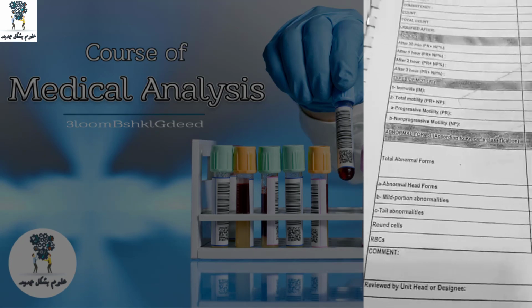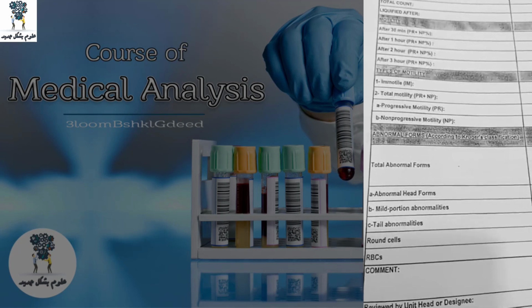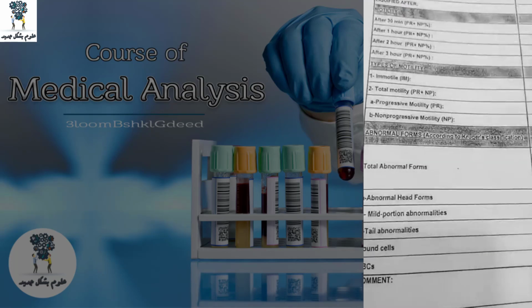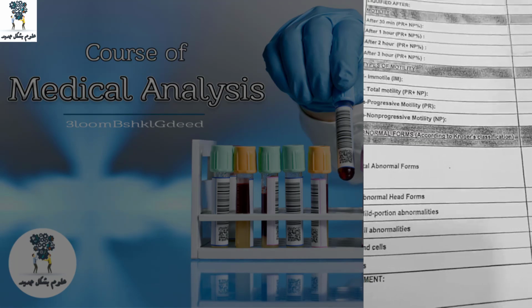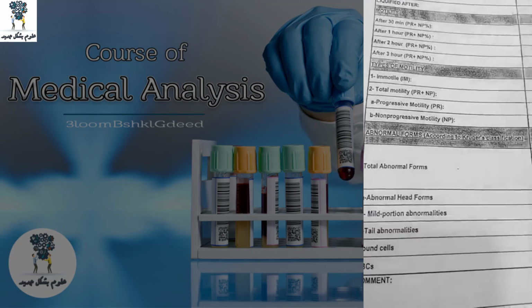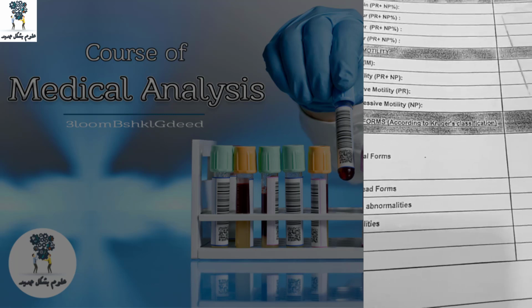طيب إيه كلمة immotile؟ عشان الناس كانت بتسأل على الترمينولوجي اللي مش عارفاها في الريبورت. immotile يعني it is a dead sperm. What is a dead sperm؟ انت لقيت sperm مش بيتحرك خالص. طيب نسبته قد إيه؟ لو نسبته عالية immotile مثلا نسبته 80%، maybe it is suspicion إن أنا ممكن أعمل حاجة اسمها vitality test.